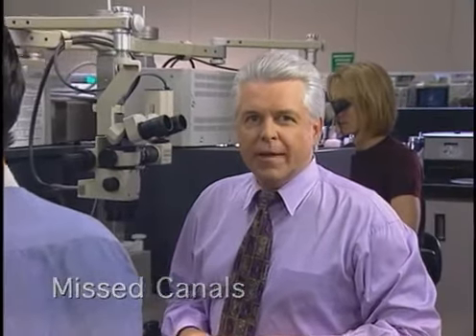Endodontic prognosis is maximized in teeth whose root canal systems are clean, shaped, and packed in 3 dimensions. A missed canal can change that prognosis. The etiology of endodontic failure is multifaceted, but a significant percentage of failures are related to missed canals which potentially harbor residual tissue, bacteria, and related irritants.